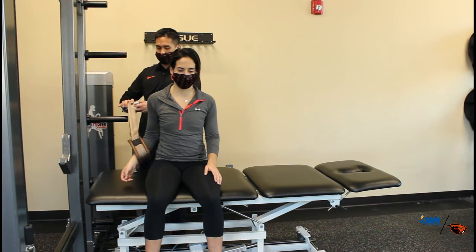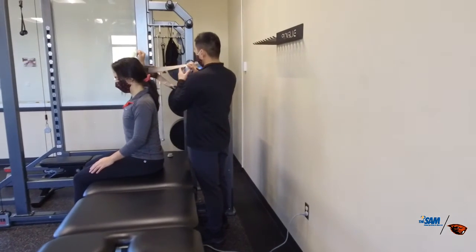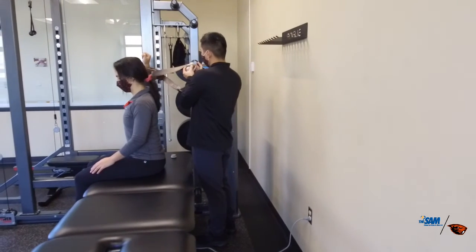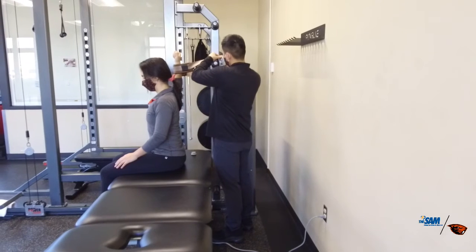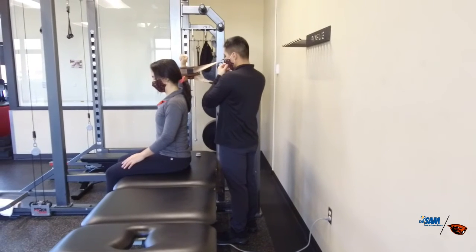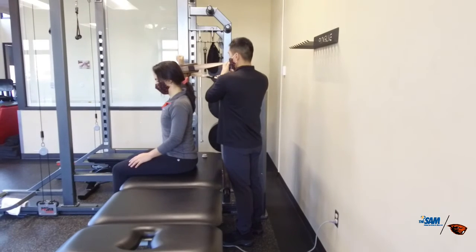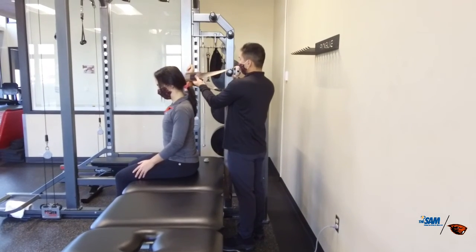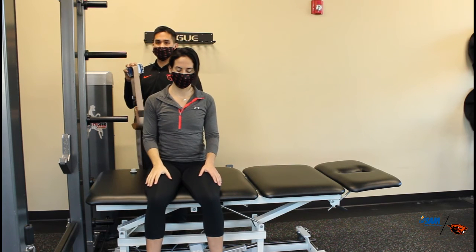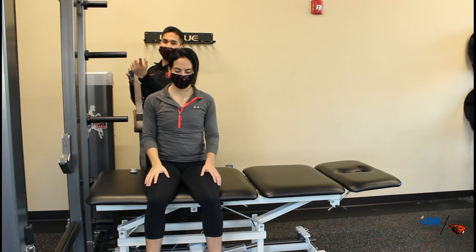So in this position, same thing. Heather's gonna get 90-90. I'm gonna put this around her wrist and then this handheld dynamometer is gonna go onto this fixed area, and then from here I'm gonna say gradual pressure and push, push, push and rest. And then from there if I want to measure external rotation I'll just have her switch around and she's pushing backwards.